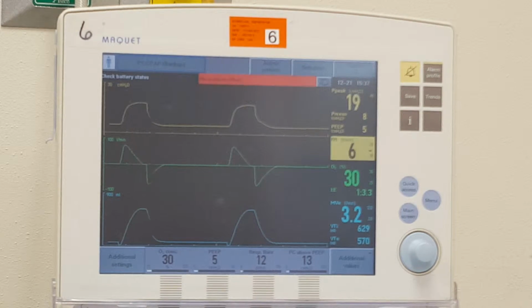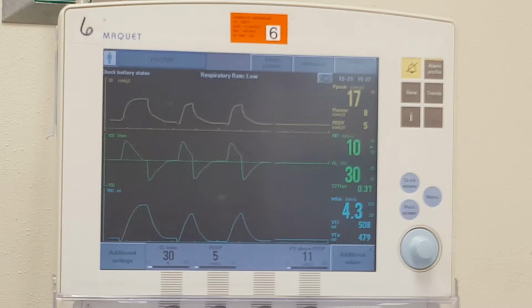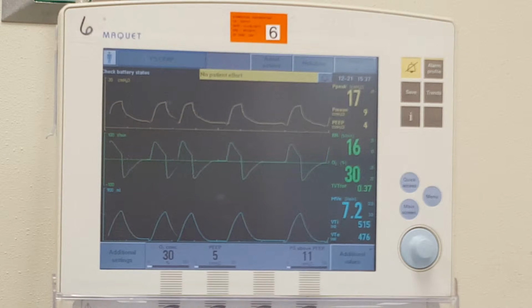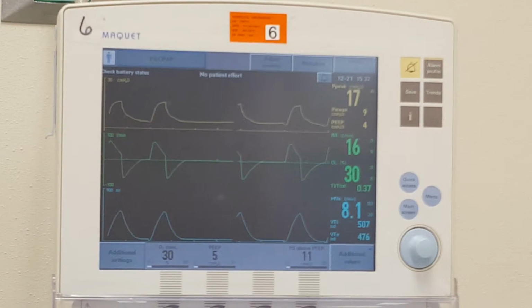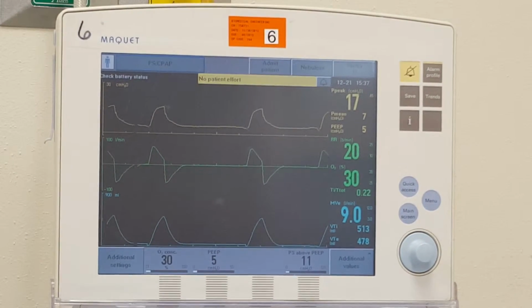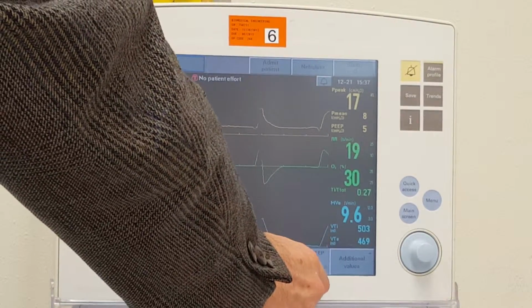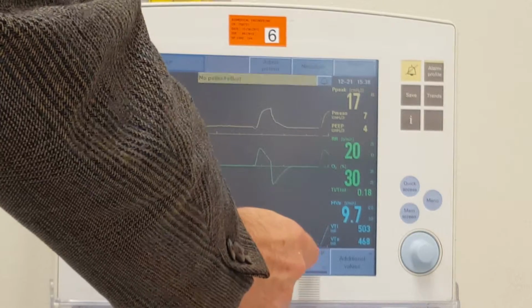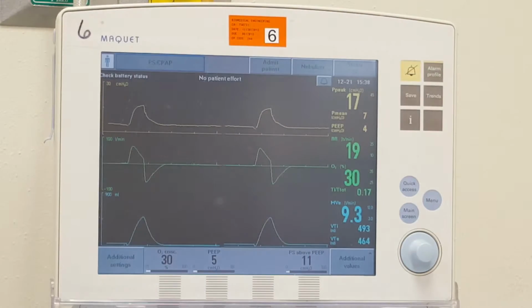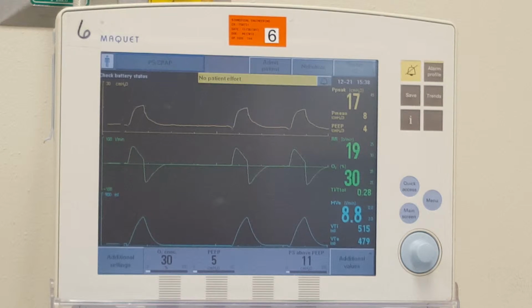Okay. Now, the last thing we want to cover here is we want to decrease, here we are, taking care of the alarm by the patient starting to breathe, but we want to decrease our compliance to 20 mils per centimeter of water pressure, okay, and see what happens. So what would you expect to happen? So we've got a delta P of 11, right, because we've set pressure support 11 above 5, which gets us our 16 plus there's 1 of overshoot. It's very common to have peak pressures overshoot by 1. So that's what we're doing there.